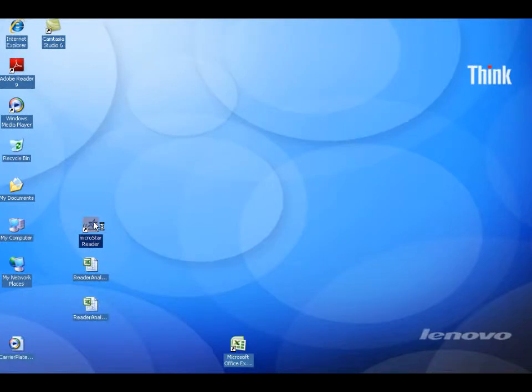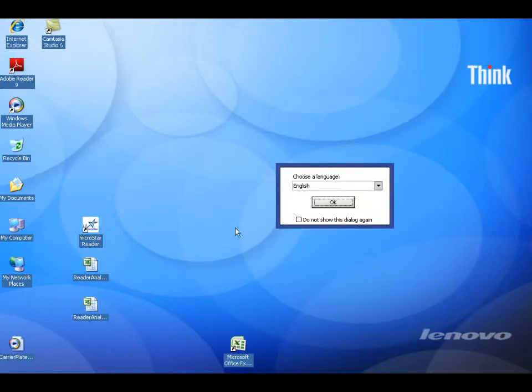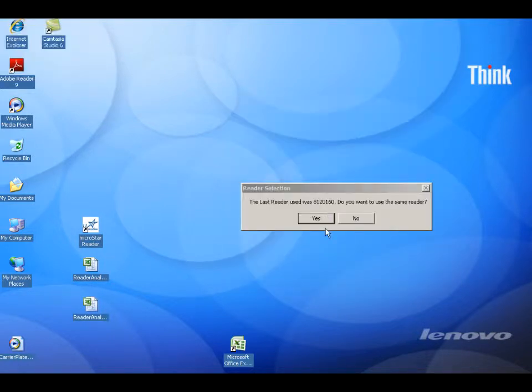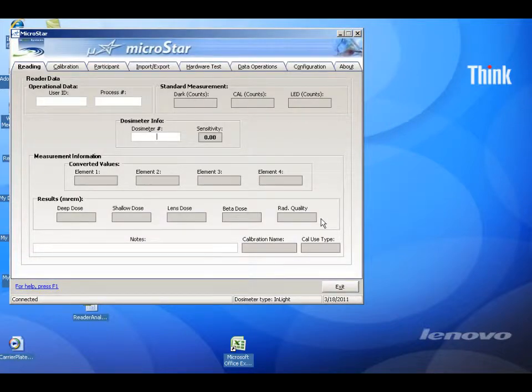Start the MicroStar software by double-clicking on the desktop icon. Click the OK button on the language option, or choose another language. The software will ask you if you would like to use the last reader used — click Yes.